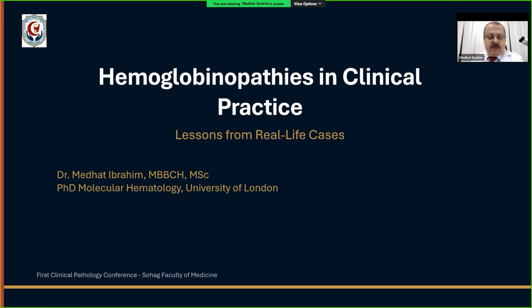My aim today is to give you a flavor or a hint of the interpretation of the hemoglobin electrophoresis, especially using the capillary electrophoresis, which in my opinion is the best machine or method to clarify the hemoglobin electrophoresis, as it gives very clear bands of the different hemoglobin contents. And also I would concentrate mainly on the adult cases of hemoglobin electrophoresis.